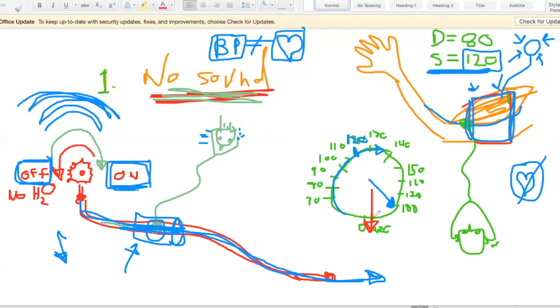So when I initially pump up the blood pressure cuff to past whatever the systolic blood pressure is for my subject, you'll crimp the entire brachial artery and stop the blood flow from going through. If you pump the cuff all the way past their systolic blood pressure, to say 180 or whatever, you won't hear anything because there's no blood flowing through the vein.